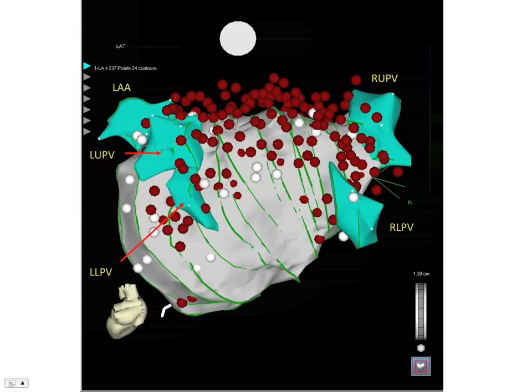Ablation was carried out using the pulmonary vein antrum isolation approach. A circular mapping catheter placed in the left atrium is initially placed at the border between the left atrial appendage and the left upper pulmonary vein. It is then used to scan the entire antrum of each pulmonary vein, starting from the ridge with the left pulmonary veins and the left atrial appendage, going across the roof and the back wall of the left atrium, across the antra of the right pulmonary veins and to the septum. Once the PVAI lesion set was complete, if patients were still in atrial fibrillation, complex atrial electrograms were mapped and ablated.